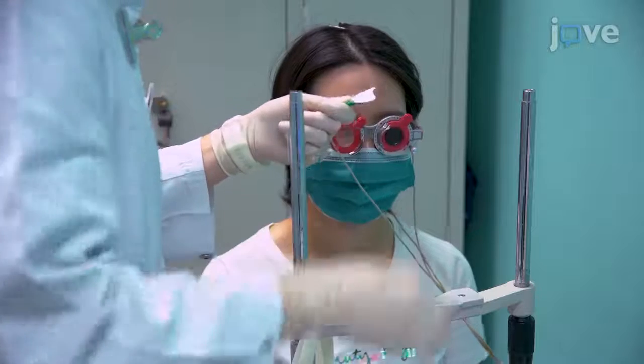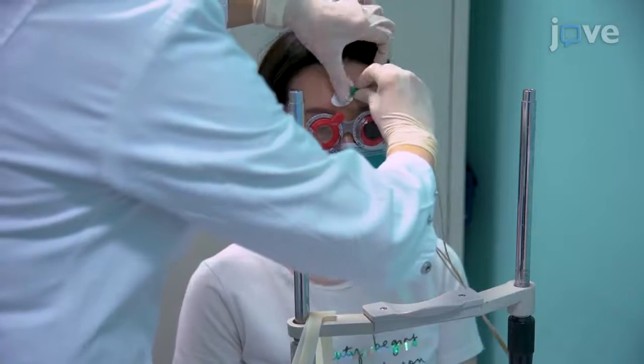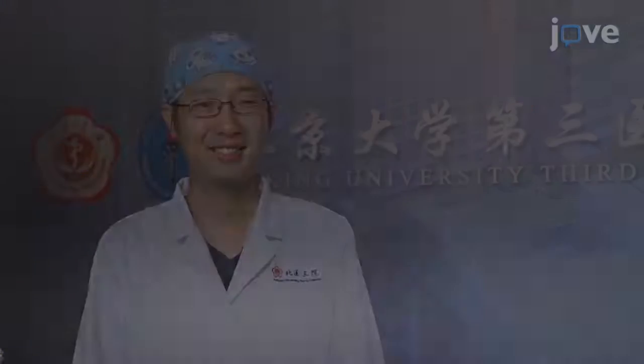This method can help answer how this unique objective electrophysiologic visual field functional measure works in the diagnosis of early stage open-angle glaucoma. This technique can selectively stimulate the M-on pathway, which is initially damaged in glaucoma, especially in the early stage.